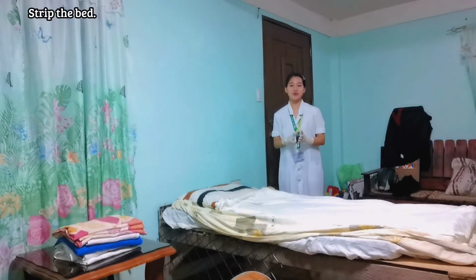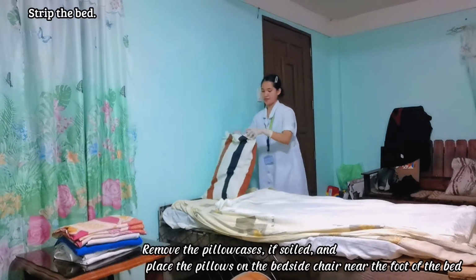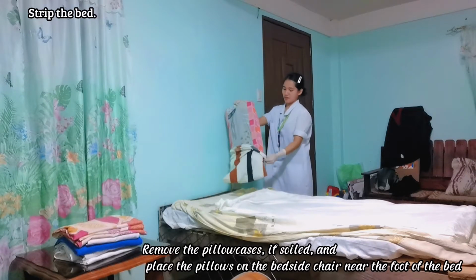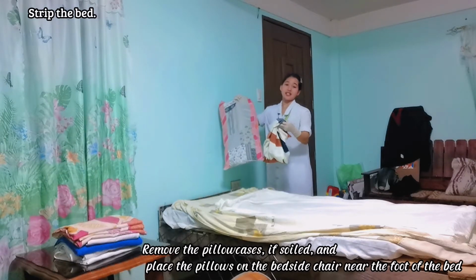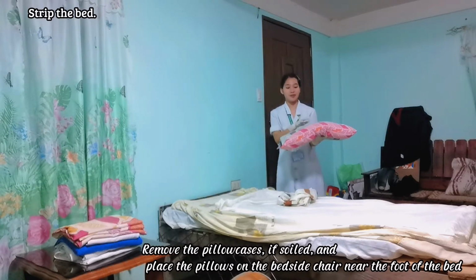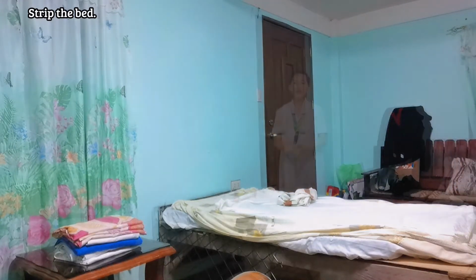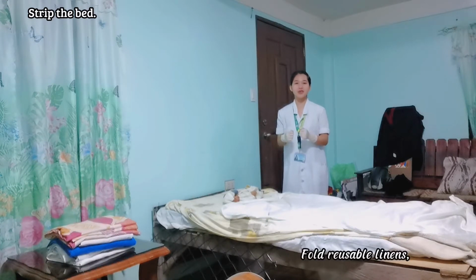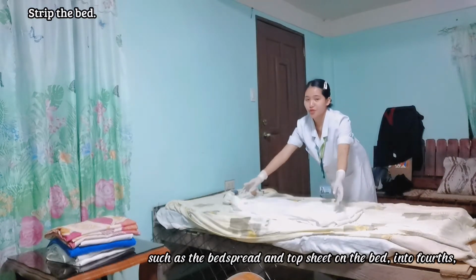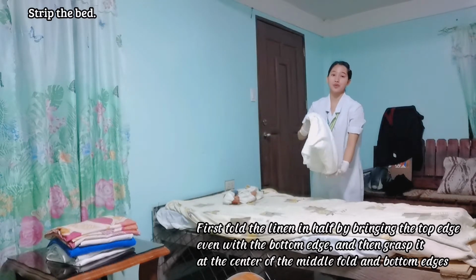Now we are going to remove the pillowcase and place it on the center of the bed. And we will place the pillow on a clean surface of the room. Next, we will be folding the reusable linen into fourths, and then place it on a clean surface of the room.